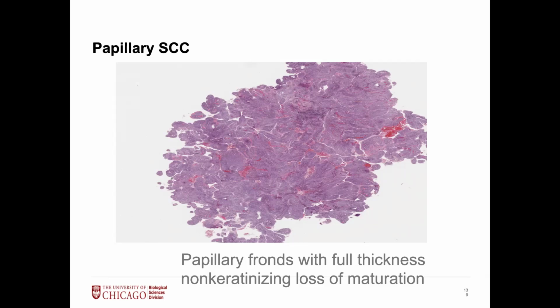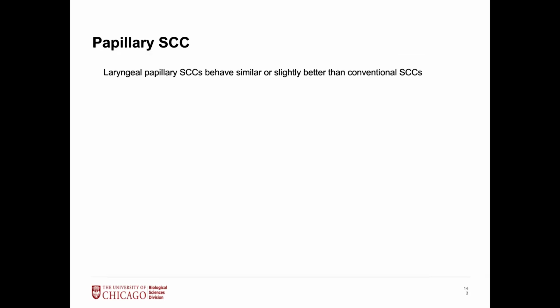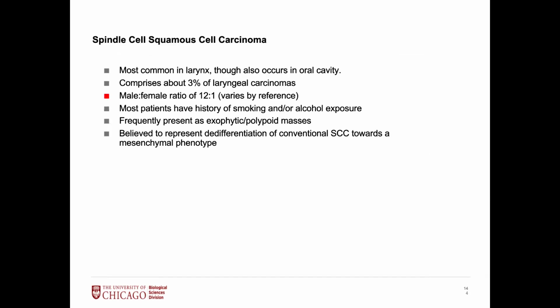But yeah, so we decide that these are probably an easier histologic diagnosis, and the keratinizing ones are the harder histologic diagnosis that requires a note. These behave similar or maybe slightly better than conventional SCCs, probably because the depth of invasion is probably not significant.